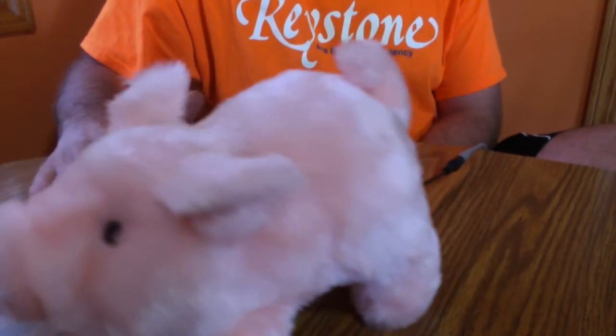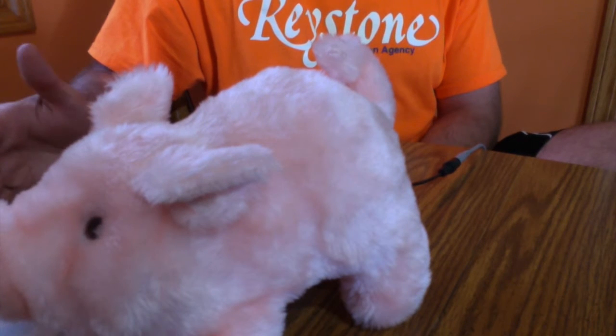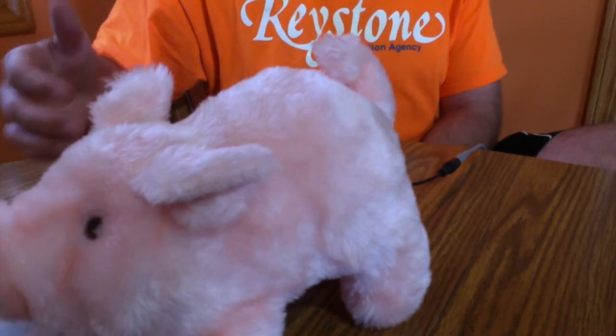turn off the toy. Once again, you'll have to look at your data and you want the child's behavior to match what the switch is expecting of them. You don't want to see random movements. You want to see the child change based on how you change the switch set.